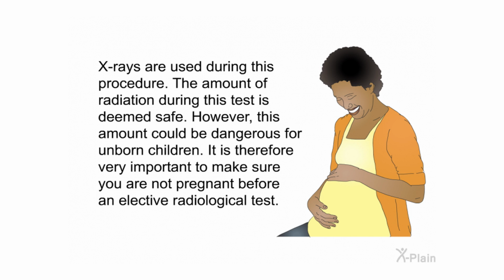X-rays are used during this procedure. The amount of radiation during this test is deemed safe. However, this amount could be dangerous for unborn children. It is therefore very important to make sure you are not pregnant before an elective radiological test.